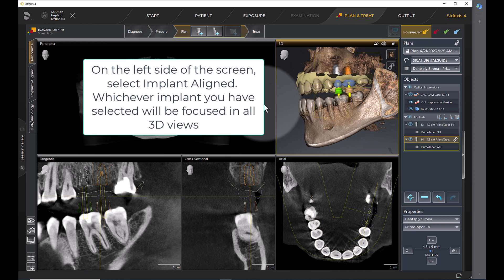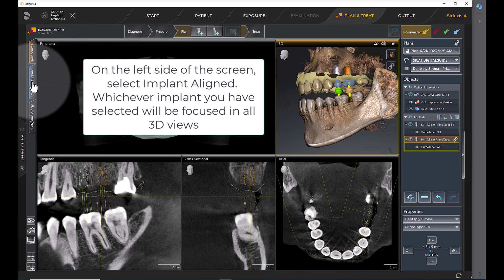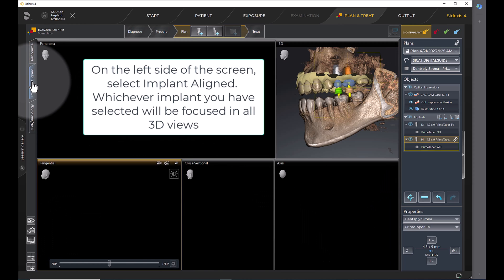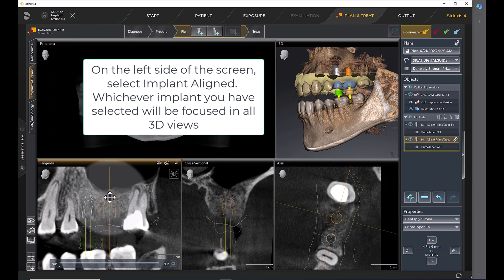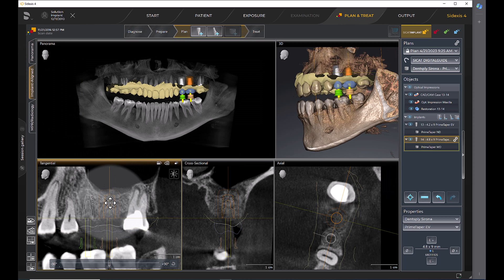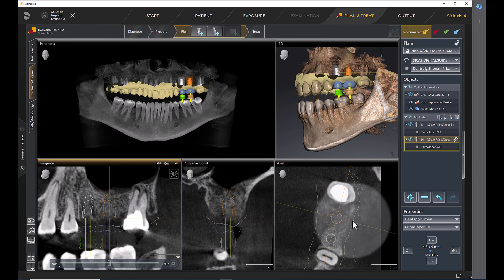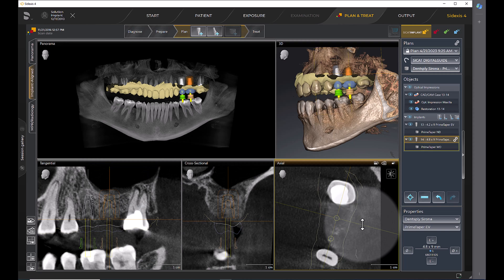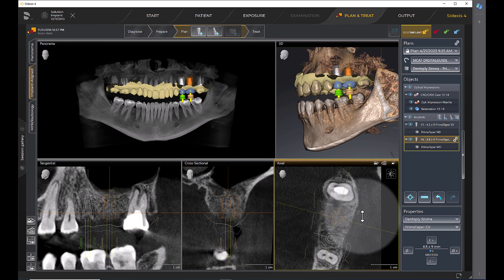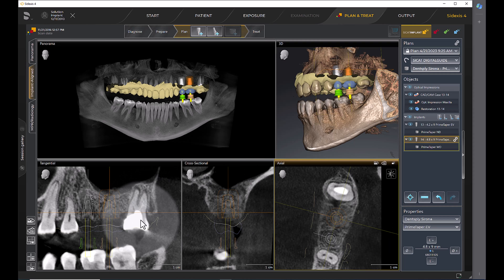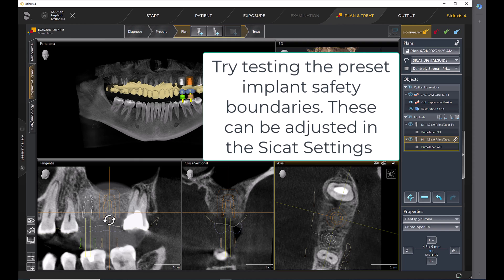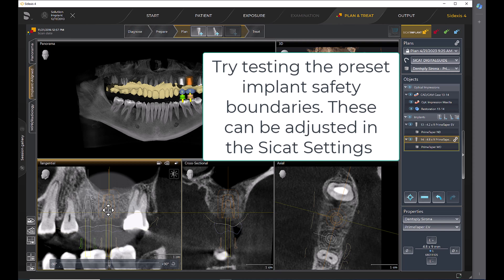On the left side of the screen, select Implant Aligned. Whichever implant you have selected will be focused in all 3D views. Try testing the preset Implant Safety Boundaries.